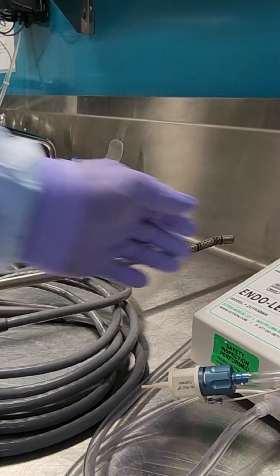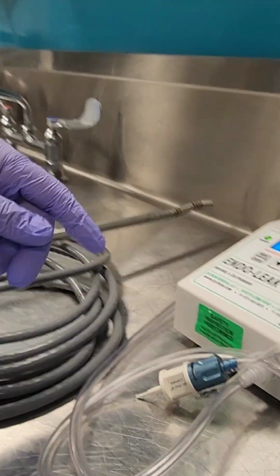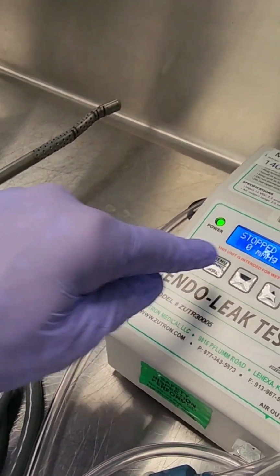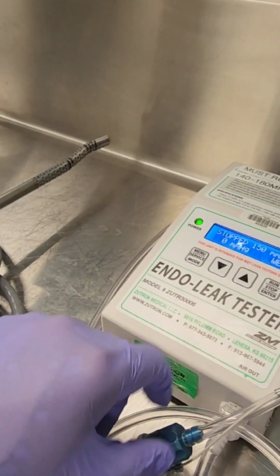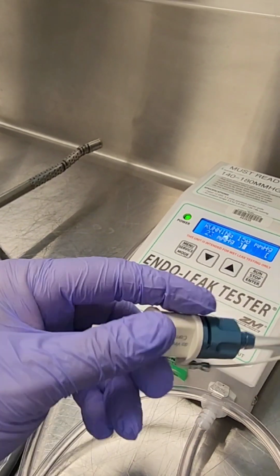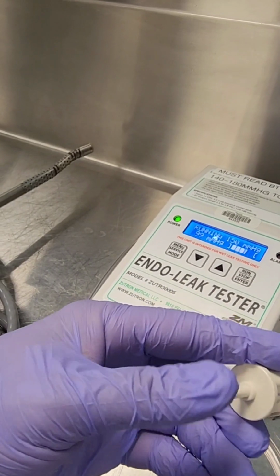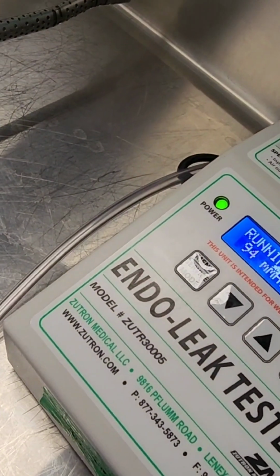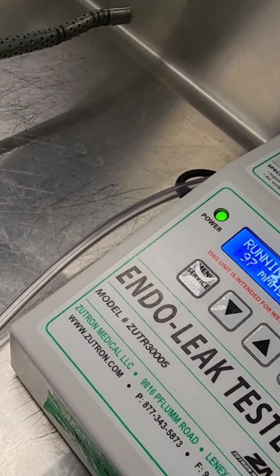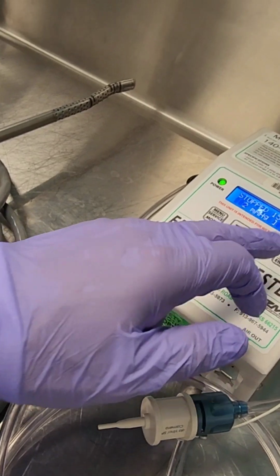Now, what you want to do, first and foremost, is turn on your leak tester to ensure that it's working. So you're going to turn it on, hit the on and off button, and then feel for air and block it to see if you change the values there. As you can see, the values are jumping all over the place from low to high. That means that this leak tester works.